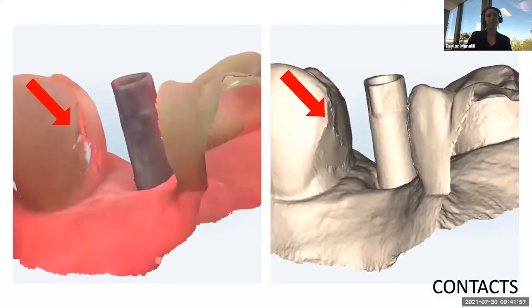Okay. So another thing I want to point out, contacts. A lot of times we see this all the time. A lot of reps from scanner companies will say you can go ahead and autofill any spaces that you may have missed, and the autofill is really accurate. So remember I said earlier, implants don't move, right? They're pretty rigid in the bone. They only have kind of movement, about like 3-5 microns, like super, super little movement.